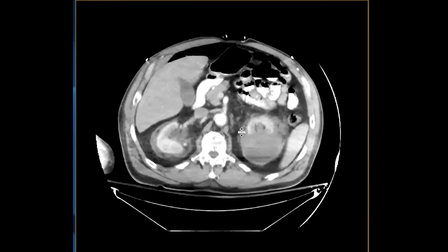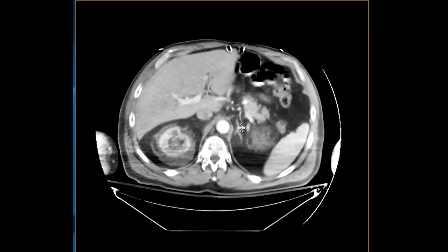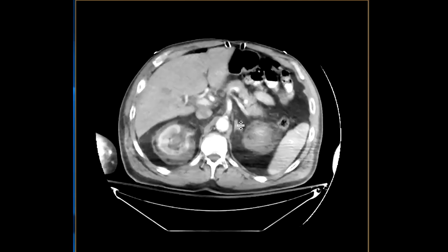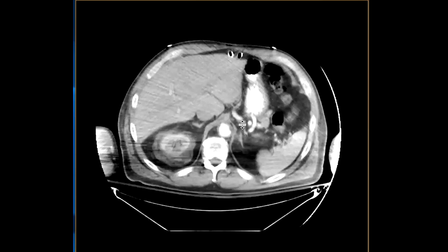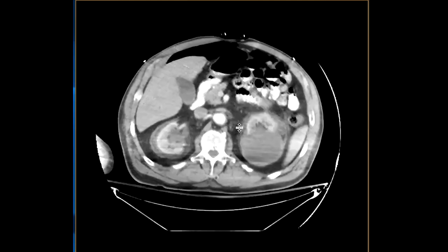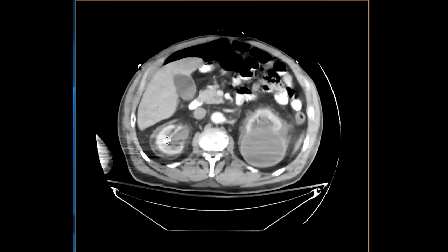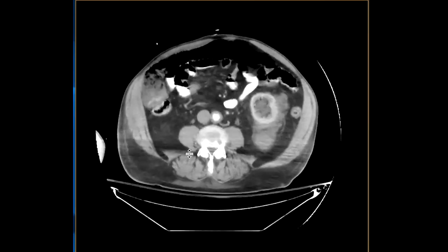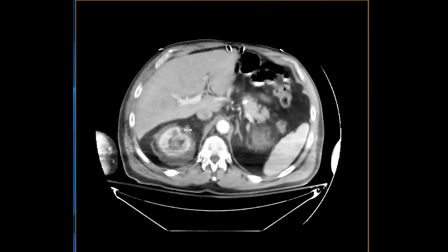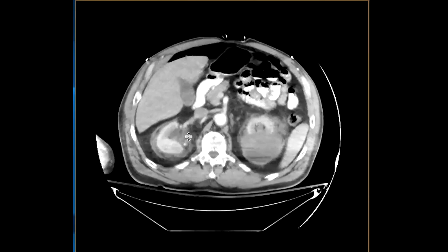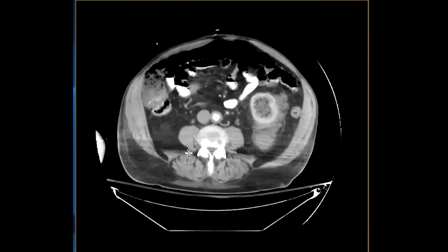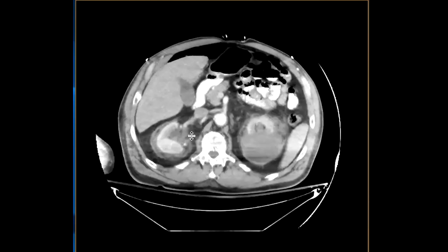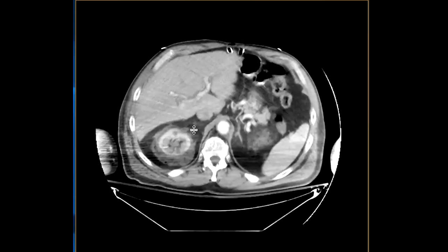In about 50% of cases there may be extraskeletal involvement. In the retroperitoneum, the most common finding is this rind of soft tissue — bilateral, symmetric, surrounding the kidneys and potentially surrounding portions of the ureters. Someone in the literature called it a 'hairy kidney,' which I certainly don't use in my reports, but it's perhaps a way to remember it when you see it on imaging.